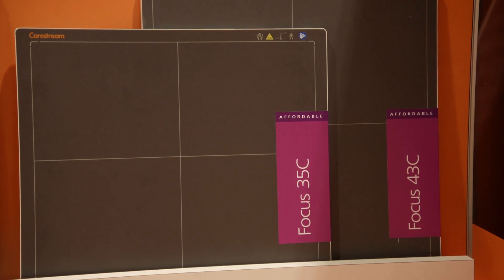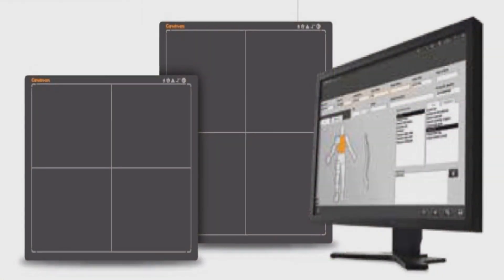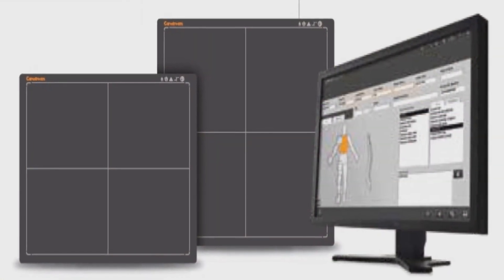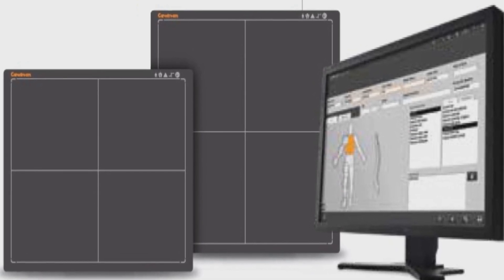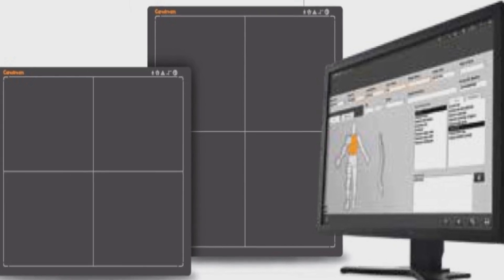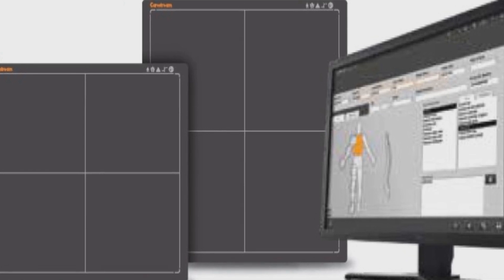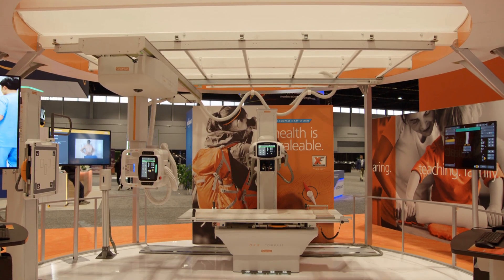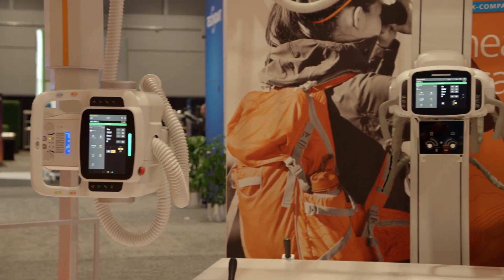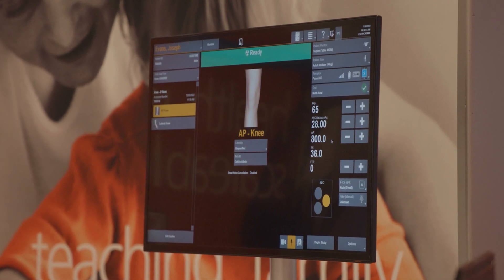Designed for smaller facilities as a retrofit solution, the Focus 35C and 43C detectors are paired with ImageSuite software. This allows a facility to leverage the investment in their current equipment by converting their existing film or CR rooms to full wireless DR. This upgrade can drastically improve workflow and productivity, and is available with mini-packs for a complete end-to-end solution. You can use the Focus detectors with our DRX Compass X-ray system — the combination delivers a scalable and upgradeable X-ray imaging room with superb image quality, all at an affordable price.